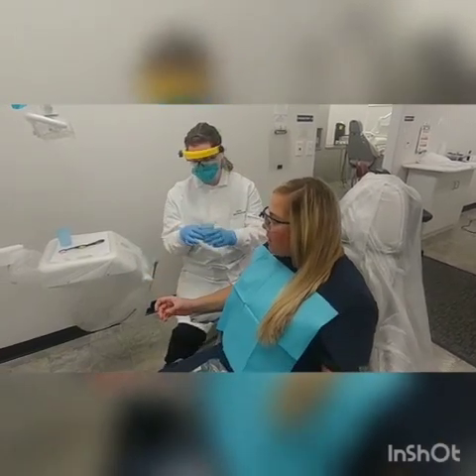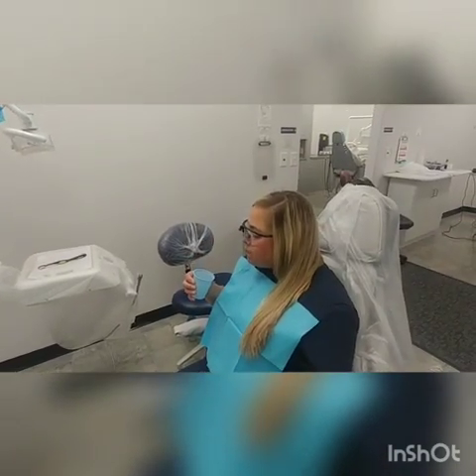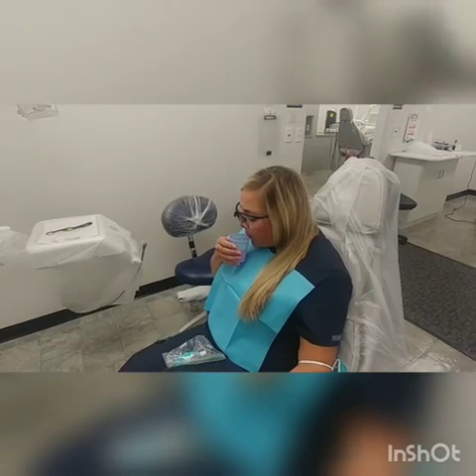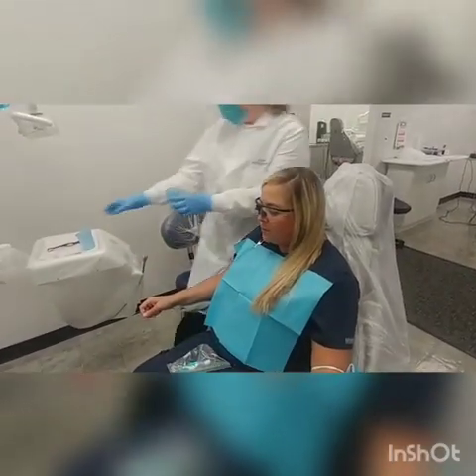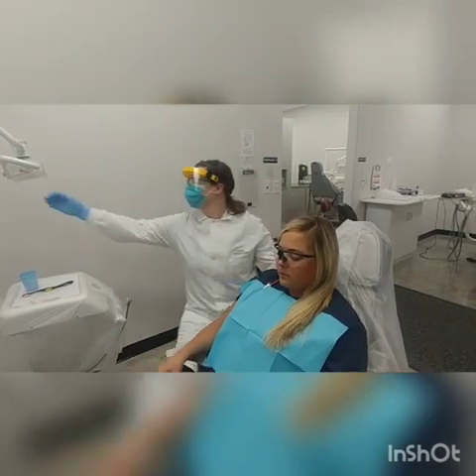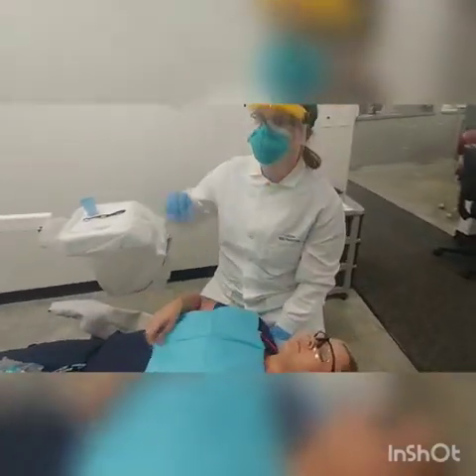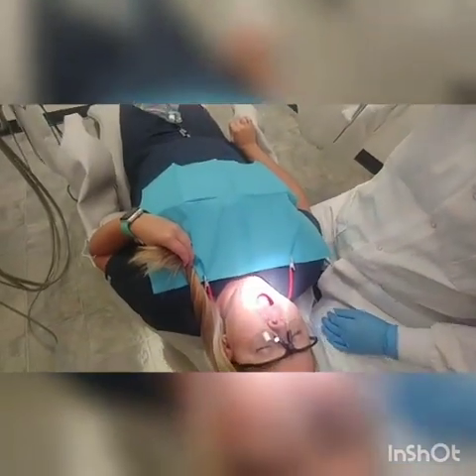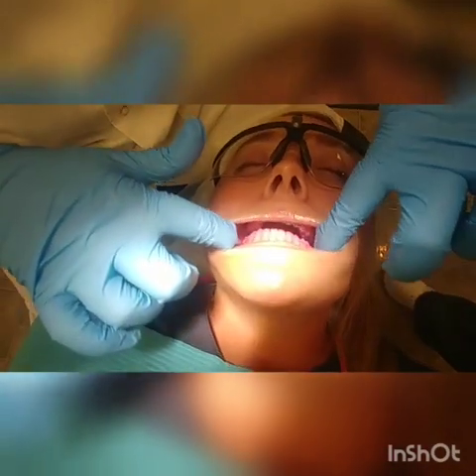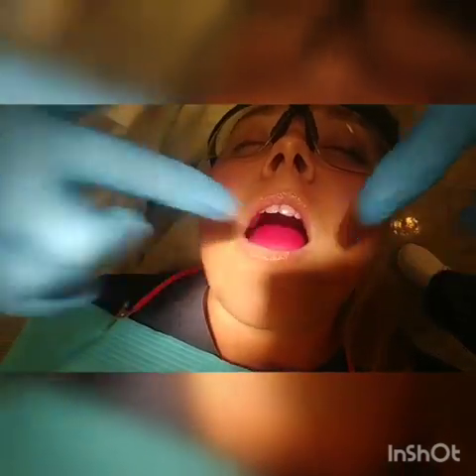Then you will place your patient into the supine position and you will rinse them with the air water syringe, and we will evacuate with the HVE. Now you're going to examine the entire dentition of the patient and just get an idea of what their current level of oral hygiene is. Just a general overview. So right now, what are we seeing? It is bright pink between the teeth and a little bit on the cervical thirds, mostly in the posterior.